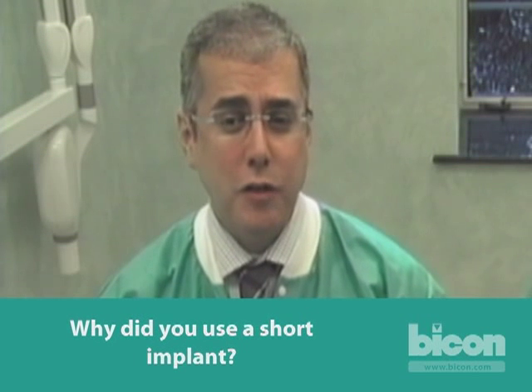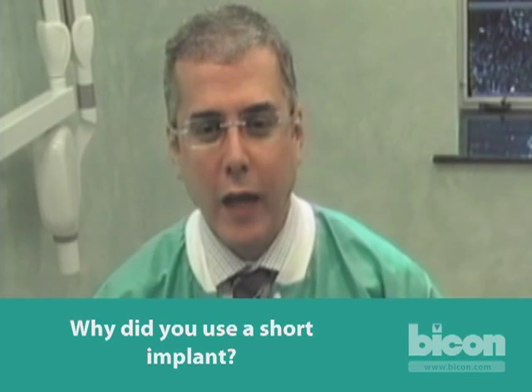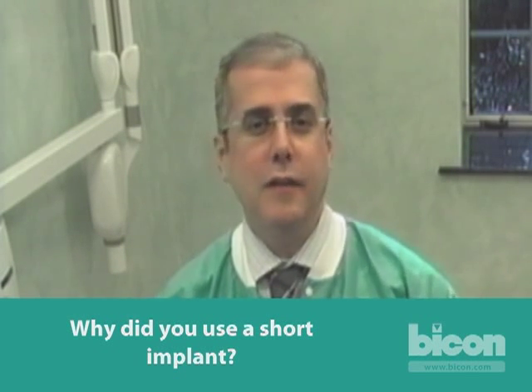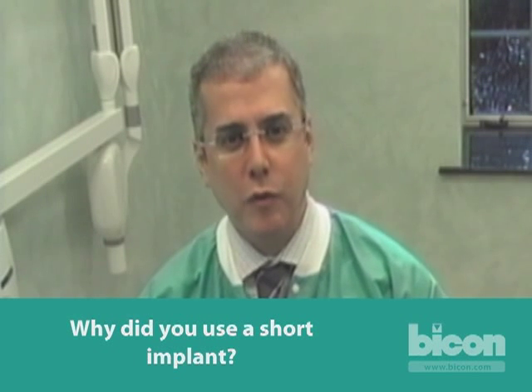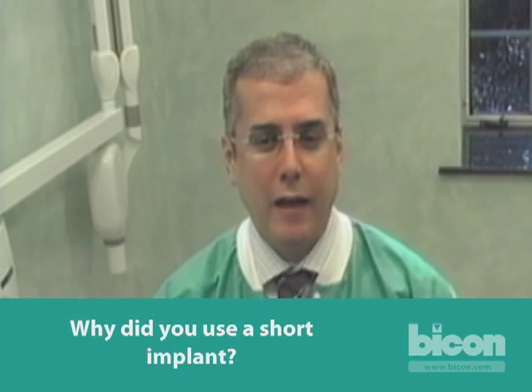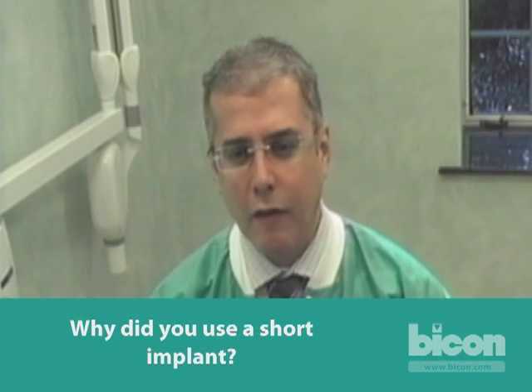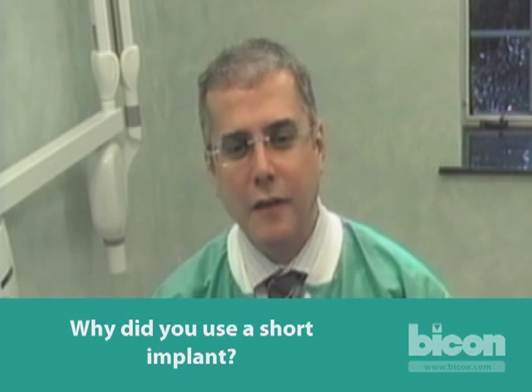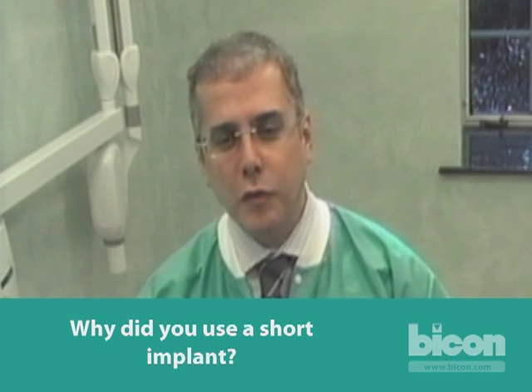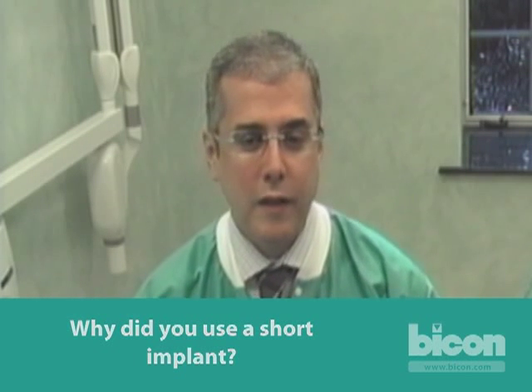The answer, in short, is why not? You saw the middle case where we had an area where a millimeter of native bone was expanded with an internal sinus lift. We placed a 6 by 5 millimeter implant and we're going to place a molar on that — and it works; it's all grafted bone. Why wouldn't it work in native bone? And clearly, we have case after case after case, we have the statistics, we have the research, there are papers published on that. If it works in the worst type of bone, this is even better — it will work in that as well.